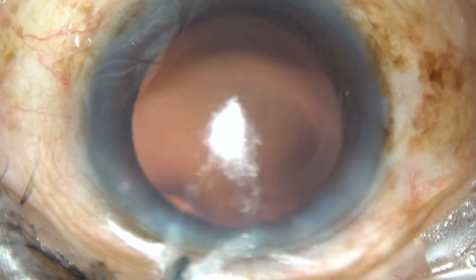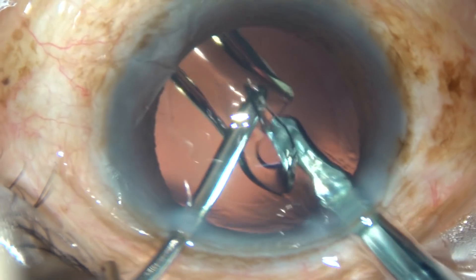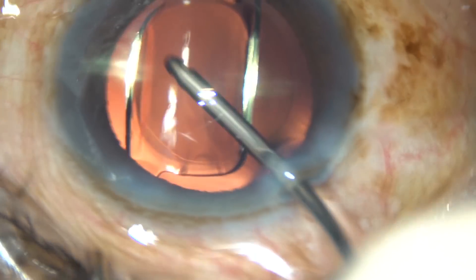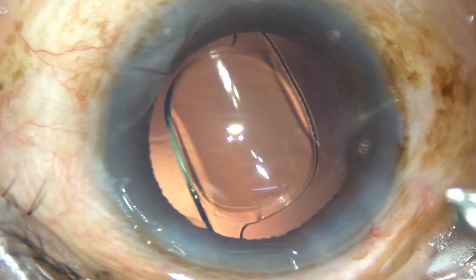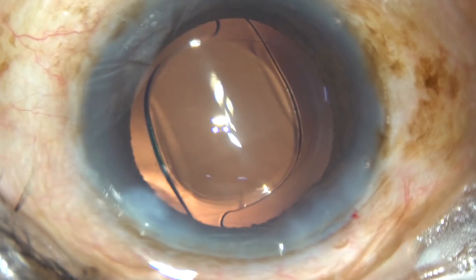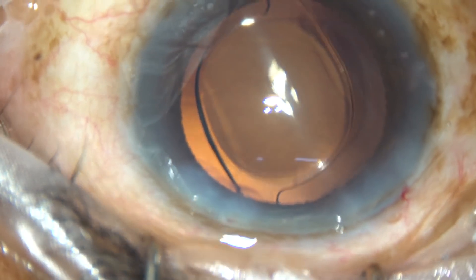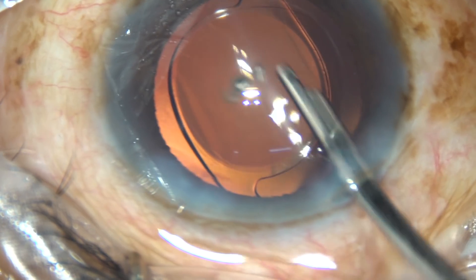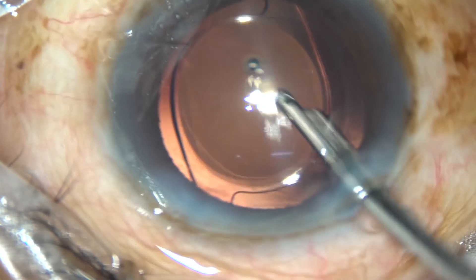Now this is intraocular lens implantation under irrigation. Dear colleagues, this is an unedited video and you are watching something like live surgery. The haptics have gone into the bag. The lens is still boat-shaped and has not unfolded completely. Now this is the final lavage of the anterior chamber with balanced salt solution. At this time, viscoelastic substance that sticks to the corneal endothelium comes out. Now the anterior chamber is formed nicely and the case is concluded.